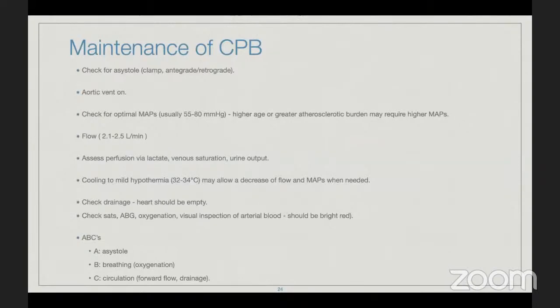Anyone knows? Well, you have a 70 or 80 kilogram patient, what is the flow? How much will you flow is a full flow for this patient? Do you take like 4 or 5 liters haphazardly, or is there any equation to determine this for these patients? Anyone has an answer? It was mentioned, if you paid attention to the first presentation of Abdullah. To multiply the target cardiac index by the body surface area.